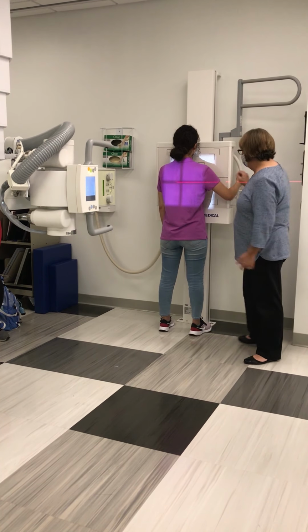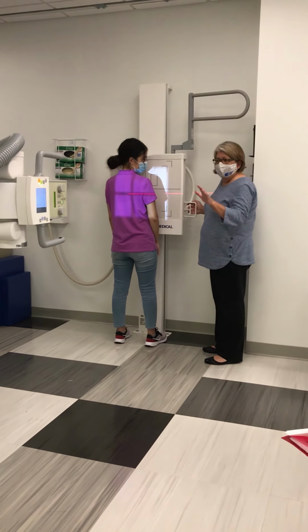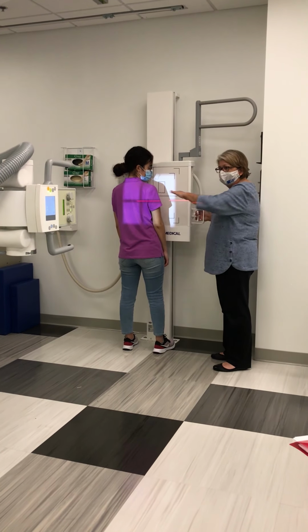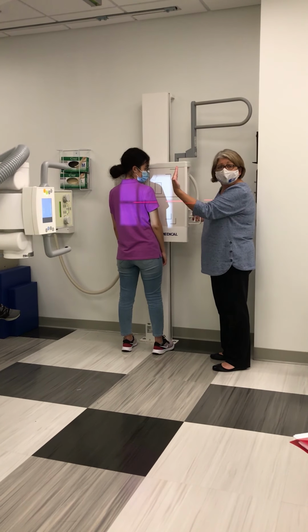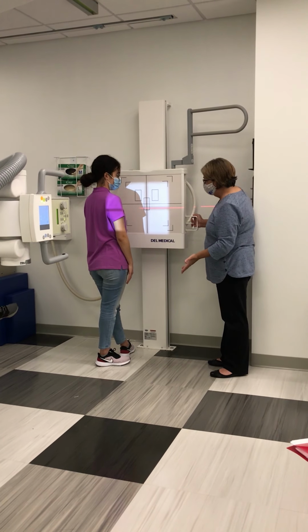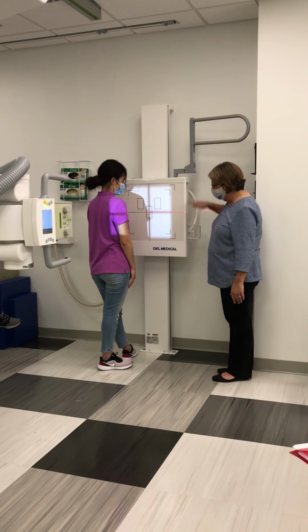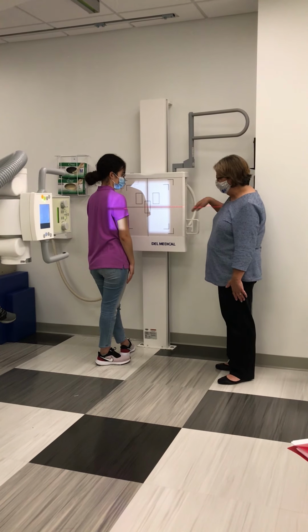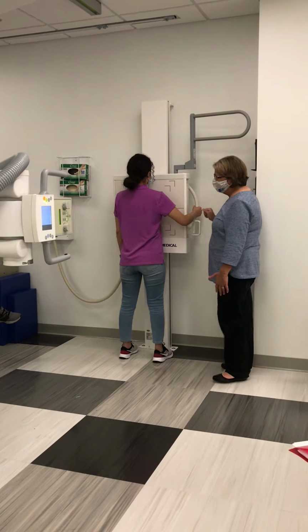Notice how when I do that, now I've got to make sure that I have my central ray and my image receptor aligned. I've got to center my central ray to my image receptor. We know that it is centered transversely because we put the tube in transverse detent to achieve that. But I have to manually move my bucky to align the central ray with the image receptor in that dimension. Okay, so go ahead and step forward again.